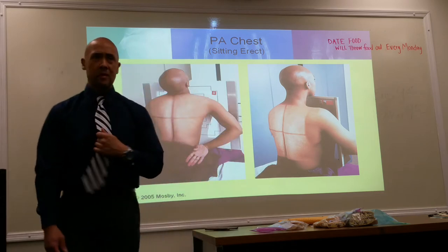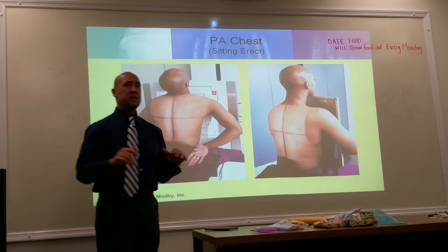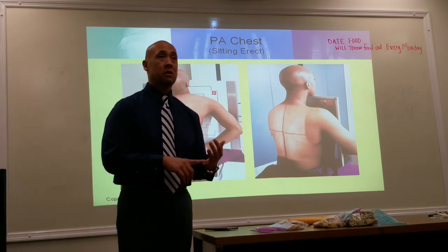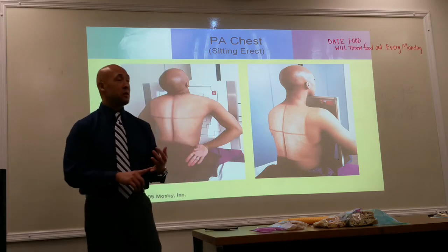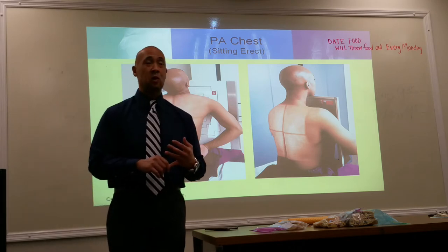Now, this is where you might see some variations. You will see technologists doing a chest x-ray with and without a grid. And your technical factors are going to vary, okay? It's one of the exceptions. Although it's greater than 10 centimeters, you can do a chest x-ray without a grid.